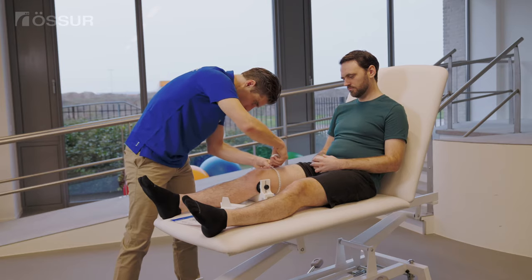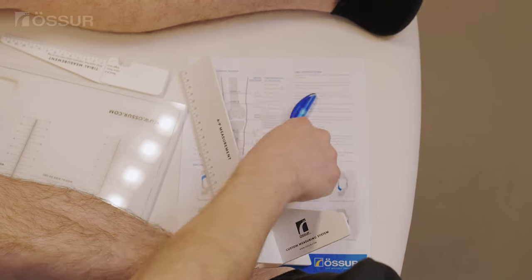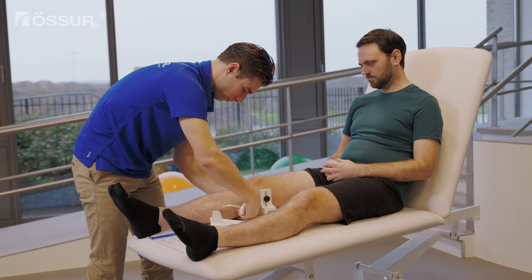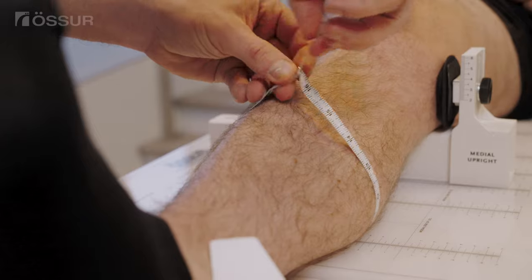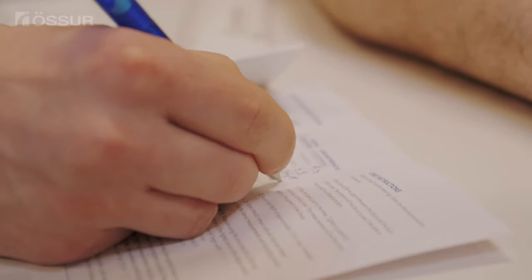When taking circumference measurements, make sure that the tape is snug but not too loose or too tight. Once the process is finalized, be sure to submit the document along with your order.